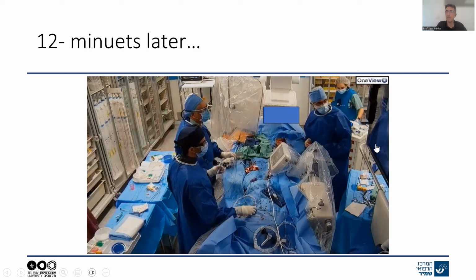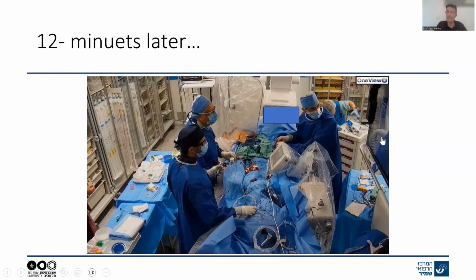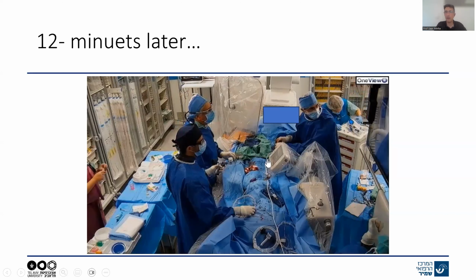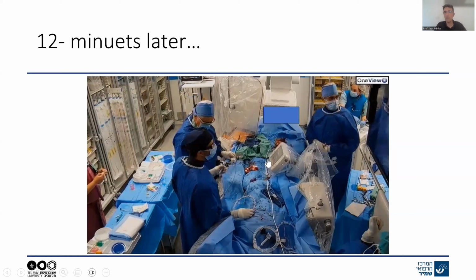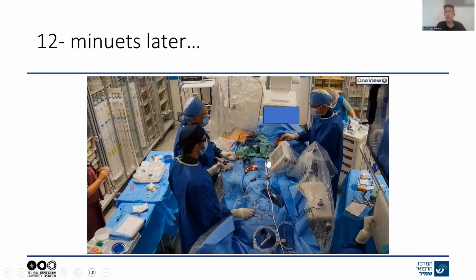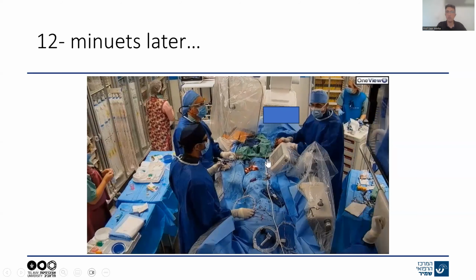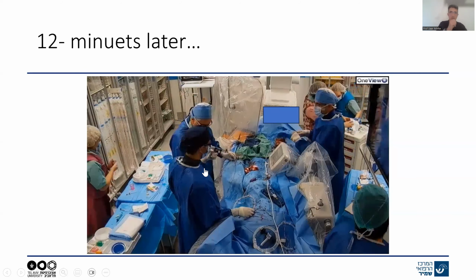We're discussing while Dr. Litovchik is fluoroing, so we can see exactly what we're doing. Everyone is up to speed, and you will see in a second they're inflating a stent. We're doing everything, and now with the use of the control panel, they will deploy a stent, and we will discuss all this part of stent implantation and support in our meeting in the future.